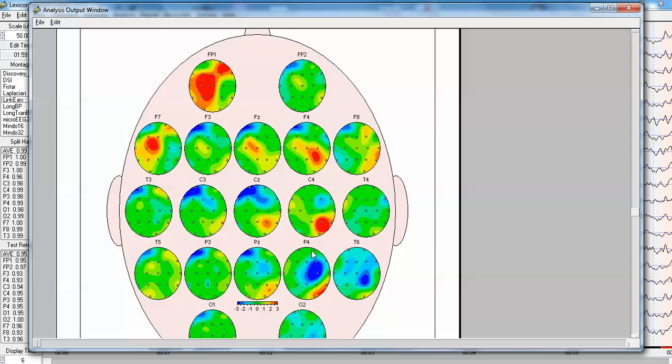Certainly no information flow from the frontal lobes to the frontal lobe. And there's no information flow or minimal information flow. In fact, three standard deviations reduced information flow coming from C4, PZ region, and even locally to itself.